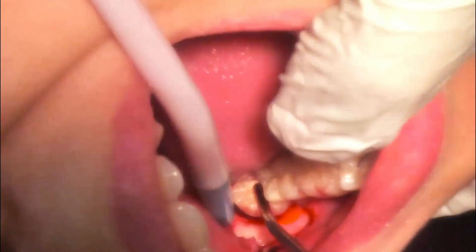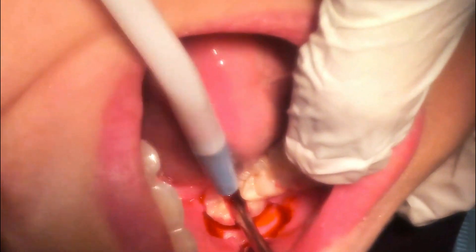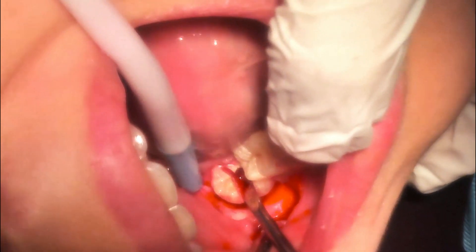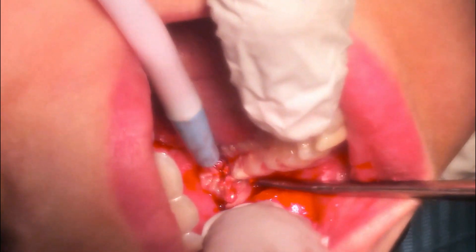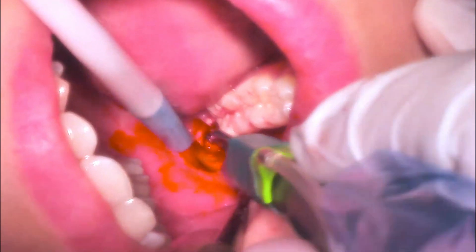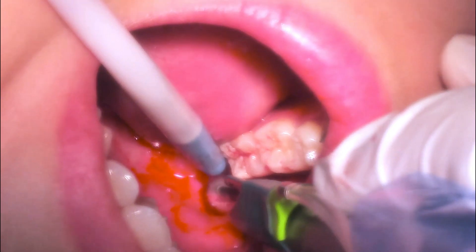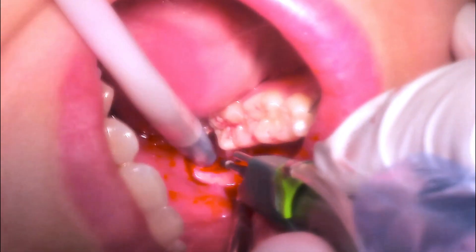I am using a straight Coupland elevator to slightly mobilize the tooth fragments. Here you can see the mesial crown structure is out and the distal crown structure breaks off as well. After this I retract very carefully and create small buccal gutters around the three roots and split the roots.